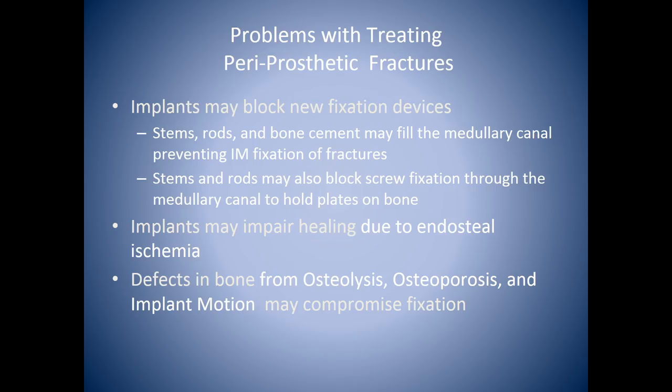The obvious problem with the PPFs is that the implants are in the canal and they will frequently get in your way and limit what fixation you're going to be doing around the actual implant. The other very important thing is this. There's been a lot of endosteal ischemia, especially with the cemented type of implants. So you're getting really poor blood supply inside and outside the bone, and very frequent non-union and breakage of implants due to this.